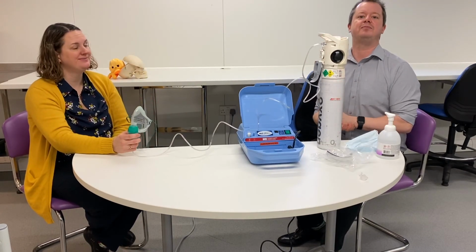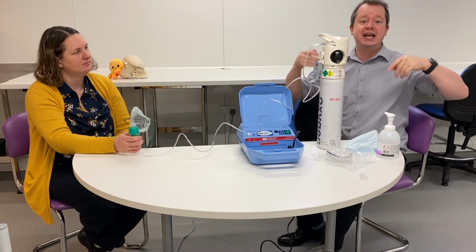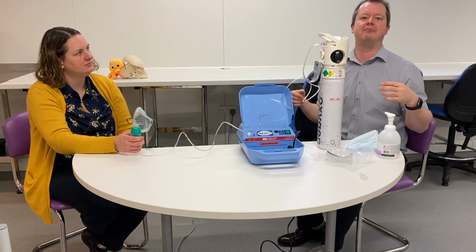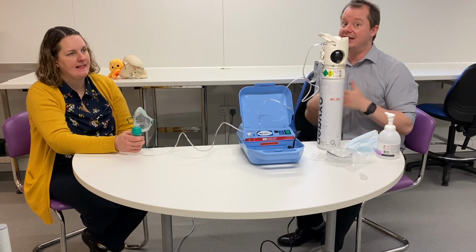I don't think so. No. It takes about 5 to 10 minutes to finish, and it's always worth telling your patient that fact so they don't become bored or disillusioned, sitting there for longer than 3 minutes wondering if it is ever going to end.